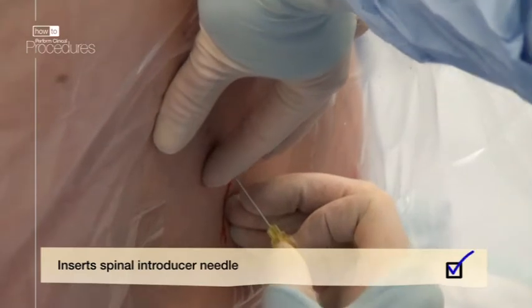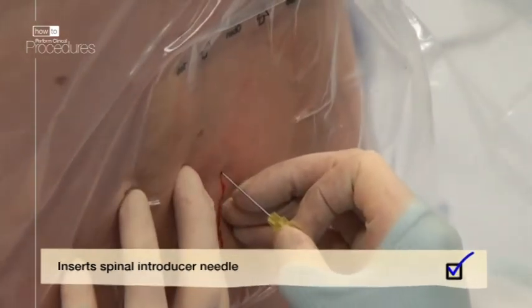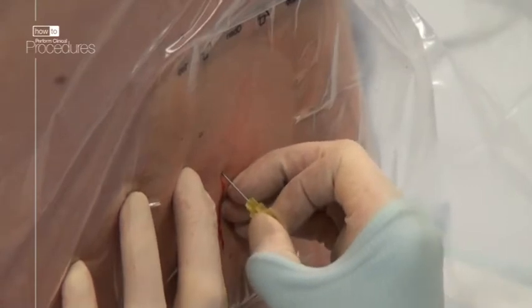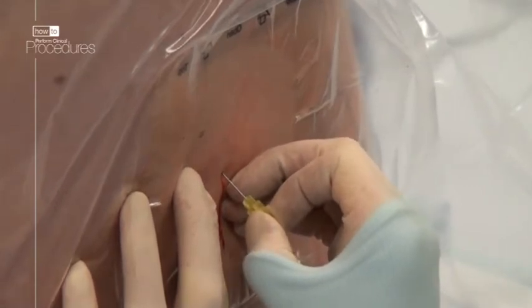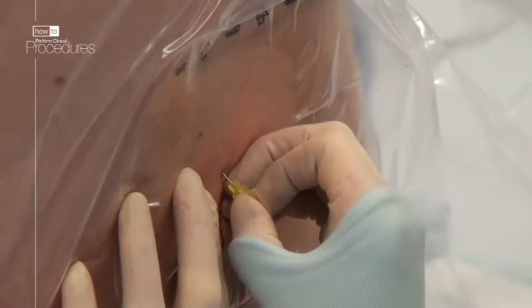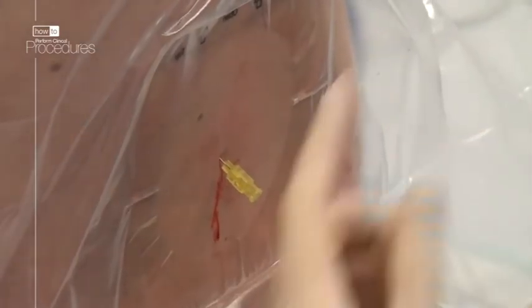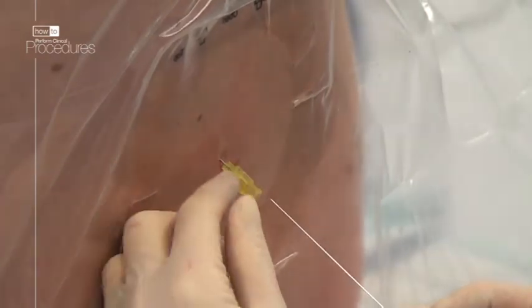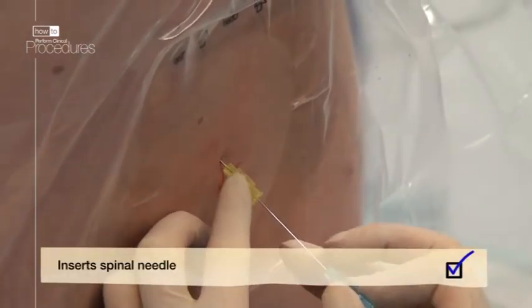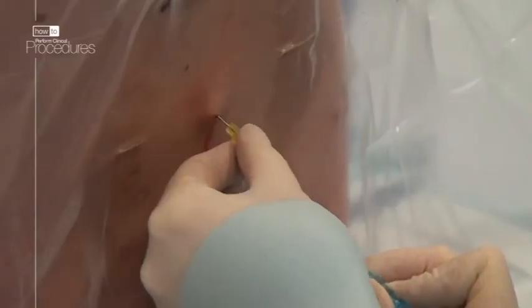Take the introducer and pass it through the skin, aiming slightly towards the head. Make sure that you're absolutely in the midline. Slowly advance it. If you hit bone, withdraw it a centimetre and reinsert at a slightly different angle. With the introducer in place, advance the spinal needle with the stylet in place. It may take a few goes to get the right angle.